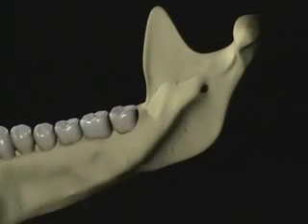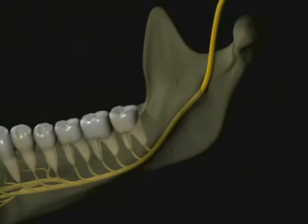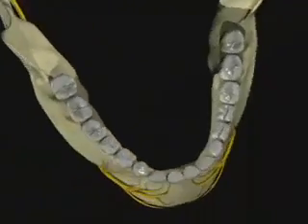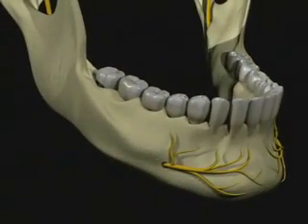As well, it is indicated for procedures on the lingual soft tissue or the buccal soft tissue anterior to the first molar. For surgery on the molars, a separate buccal nerve block is required. The nerve anesthetized by this block is the inferior alveolar, which innervates the pulps of the mandibular teeth in that quadrant from the third molar to the central incisor. The buccal periodontium anterior to the first molar is also anesthetized through its innervation by the mental nerve.